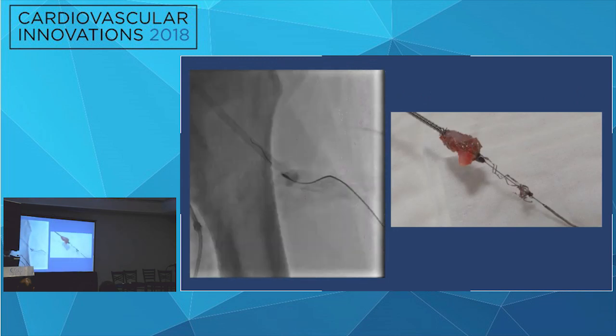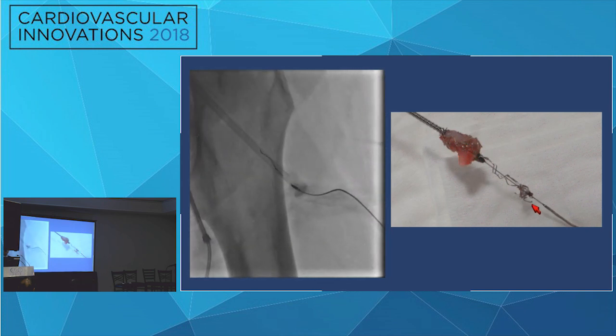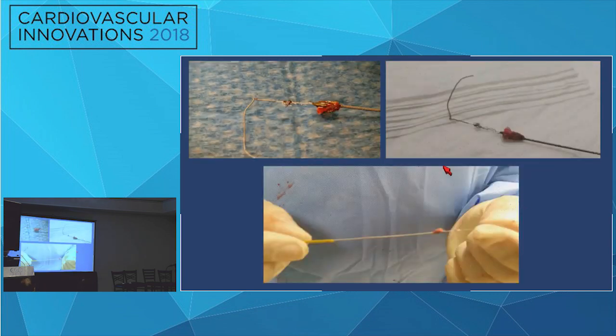So this is what I found. The rota burr chewed a very old stent, longer than 3 years. It was deployed longer than 3 years ago. Part of the artery came out, and there's some stent here, also there. This is the tip of the wire with a lot of old stent here, and this is the guide liner. The patient continued to be hemodynamically stable, which was great.